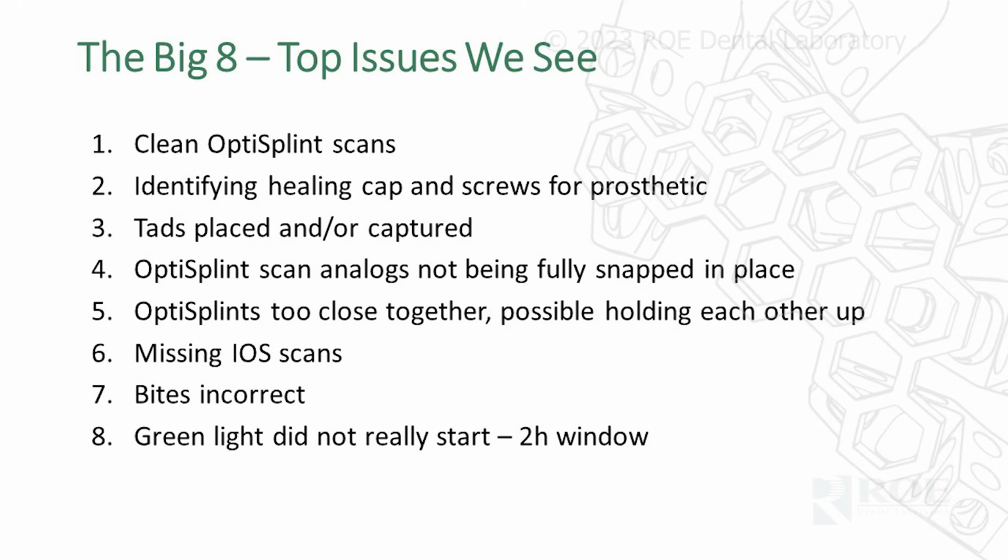Be careful that OptiSplints are not too close together, right? They can't touch. And if they are touching, adjust them. I'll show you a couple cases on that.